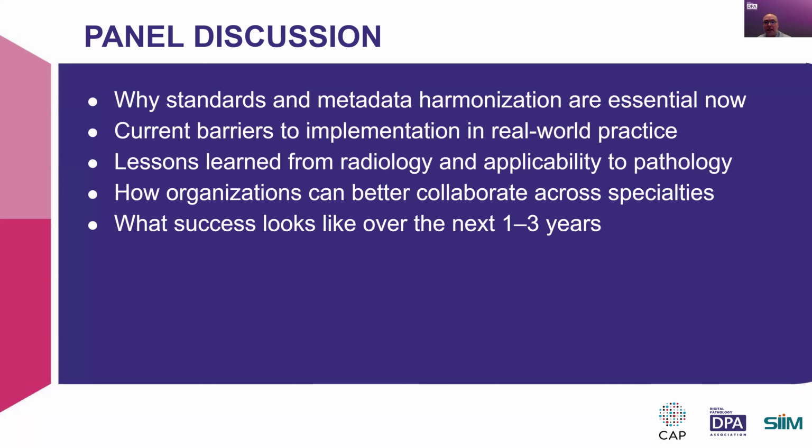No, I think, yeah, I'm sorry, John. I want to go ahead and add to Dr. Dash and also Dr. Tobin that every day I hear there is this misconception that there are multiple versions of pathology DICOM, and which pathology DICOM we are using, when it is one DICOM standard. It's not split by specialty. What really exists is the supplement, as Dr. Tobin, Dr.